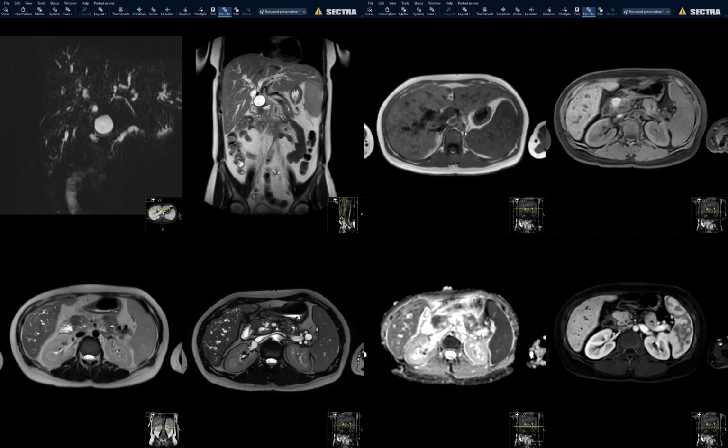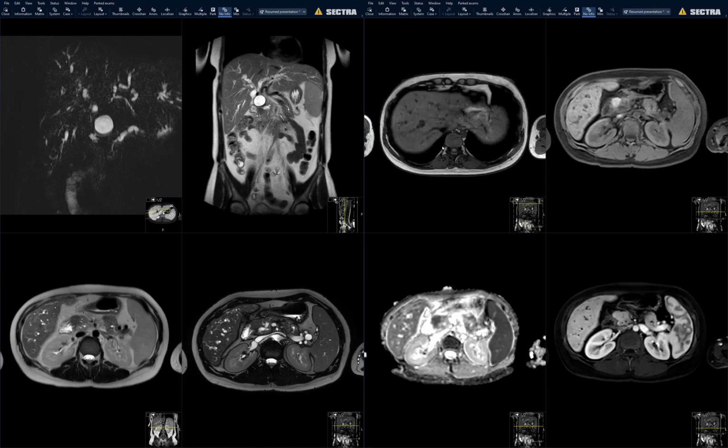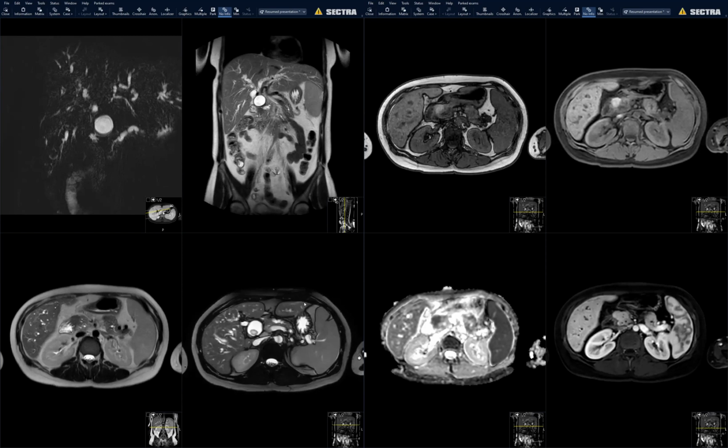But I do agree that if it was a hematoma, I think it could obstruct the ducts. But those ducts are just so weird. I feel like she has some kind of diffuse biliary abnormality. I should get a follow-up on this one, because again, I can't explain the CA 19-9 of 20,000. Yeah, nothing explains that.